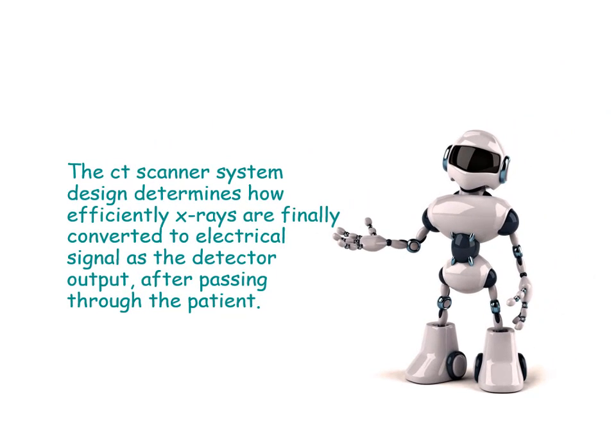The CT scanner system design determines how efficiently X-rays are finally converted to electrical signal as the detector output, after passing through the patient.